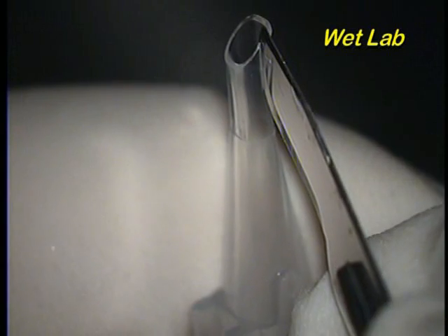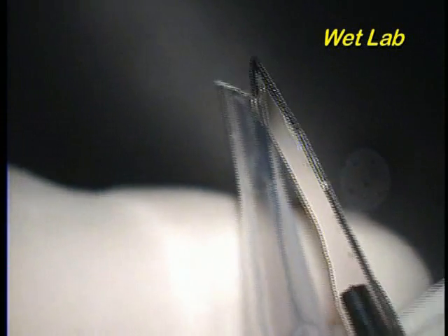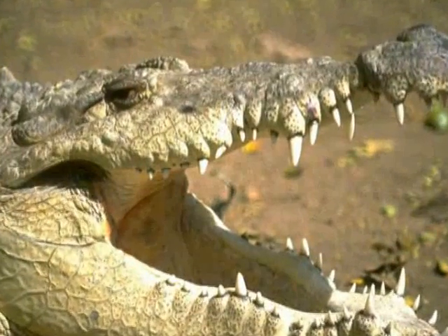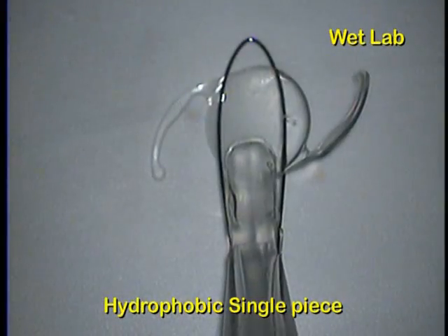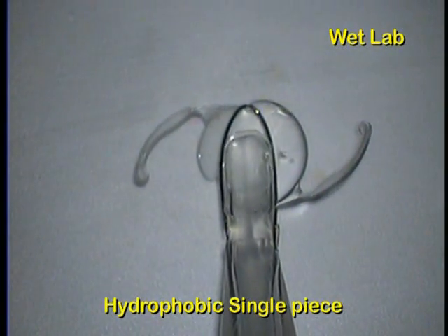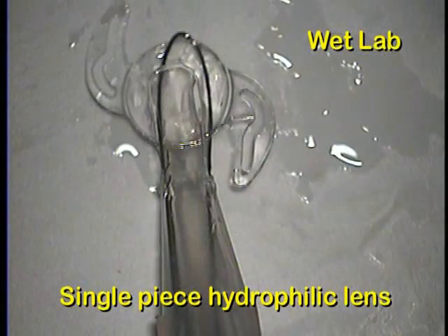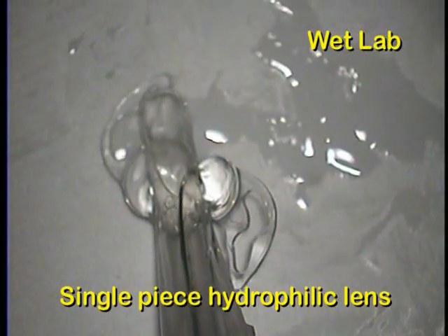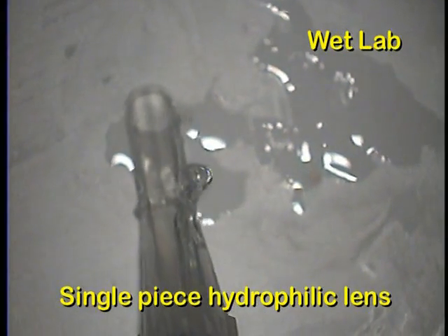An additional cushion was acquired by placing the snare inside a Monarch A cartridge. The tip of the cartridge was cut open a few millimeters from the tip on either side, acting like a jaw that could open much wider. As this modified snare with the cartridge was tried on the hydrophobic lens, the whole lens folded itself like a newborn making its way comfortably through the birth passage. The same technique was successfully applied to hydrophilic acrylic lenses in the wet lab. The modified cartridge can easily accommodate more mass as its opening becomes wider.